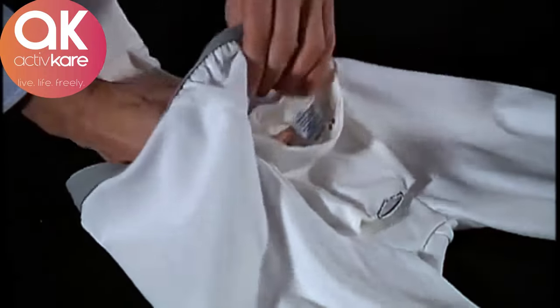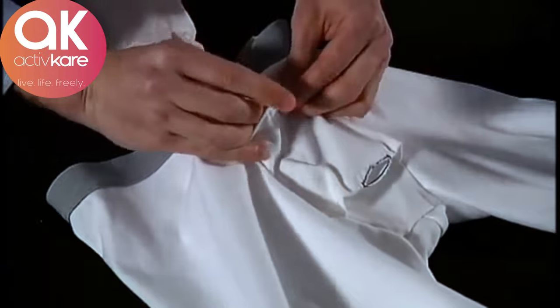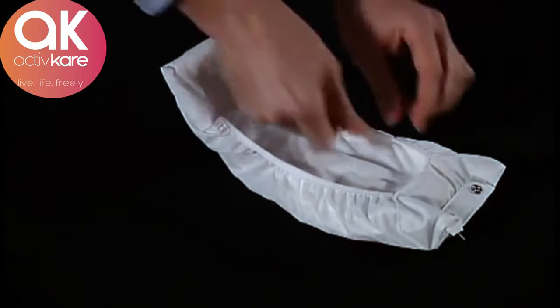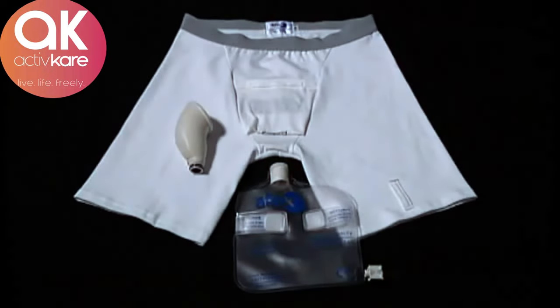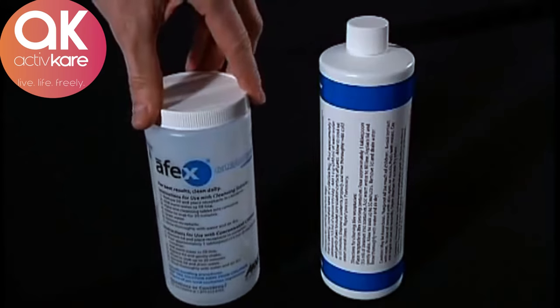Simply remove the receptacle and snap the pad into the horizontal fly. Then stabilize it in the back with the Velcro tab. To launder the pad, lift up the front tab and pull out the absorbent layers. To ensure proper maintenance of your Afex system, we recommend that you clean your receptacle and collection bag on a daily basis. Follow the detailed instructions on the cleaning container and cleansing solution.